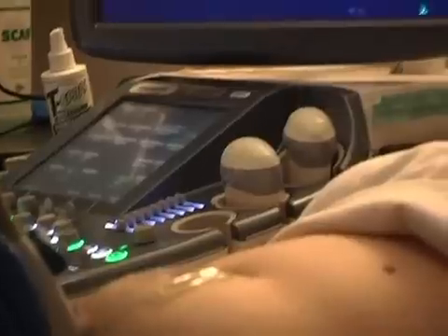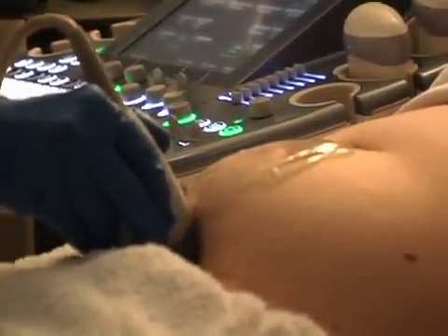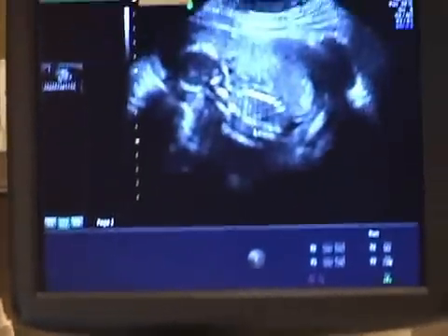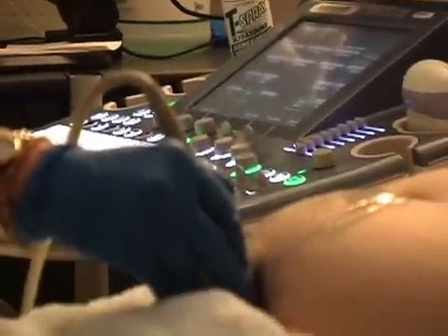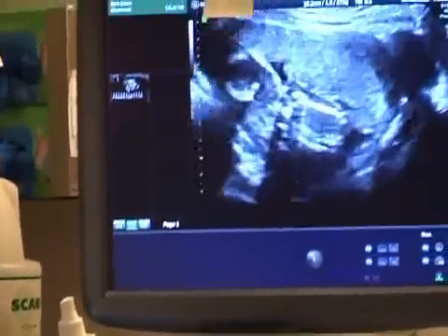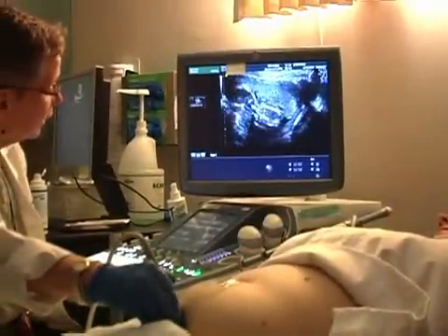You'll see the head up here, and I'm starting to see the spine right here. This is the cervical spine. I'm going to turn my transducer in a little bit of a counterclockwise direction, and I can start to see the spine elongate. The probe is in an oblique position, again with the head up here, and when I make my transducer so the spine looks like a spine right here, it is in an oblique position. So the fetus is coming with its head first, the spine coming oblique.